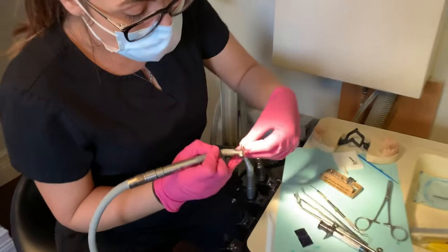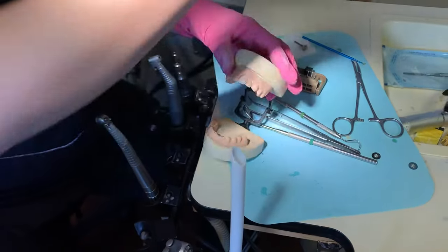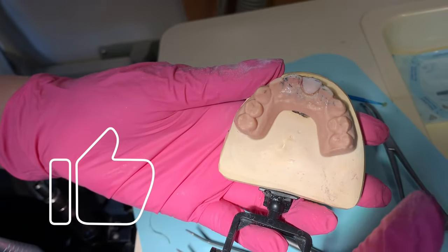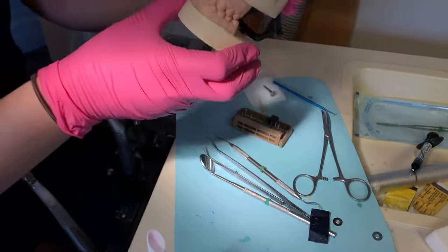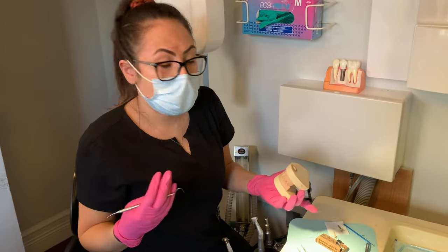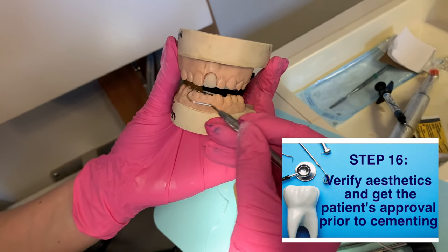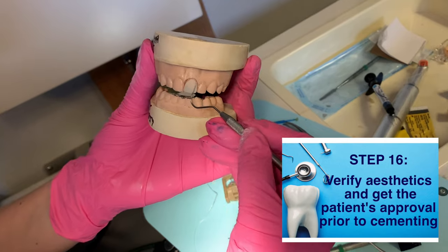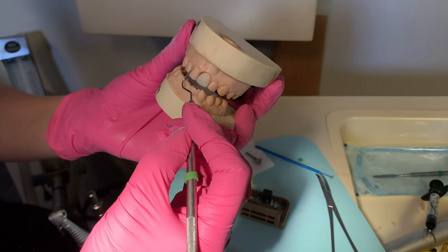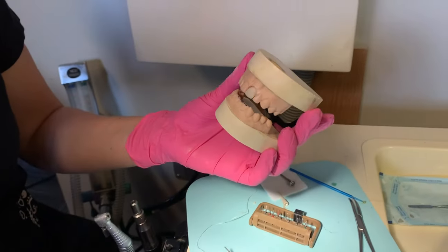I'm going to go ahead and adjust a little bit more. That's good. Another thing you want to make sure — it's your front tooth. What would you like your front tooth to look like? Is it looking like it belongs there? Is the length matching the adjacent teeth? Is the bulkiness right? You don't want this tooth to be flat and then your temporary bulky. You want to make sure that it's matching the next tooth. In a model it's hard to tell, but it seems pretty good.